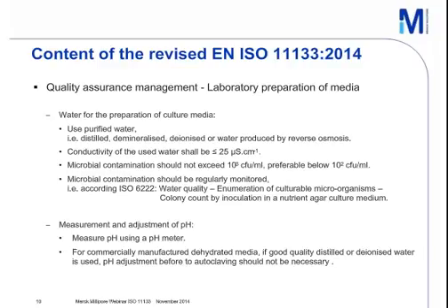A big part of the standard is the laboratory preparation of the media. To point out only some, water is one of the biggest. Water for the preparation of culture media is very important. It is given by the standard to use purified water, for example, distilled, demineralized, deionized, or water produced by reverse osmosis.